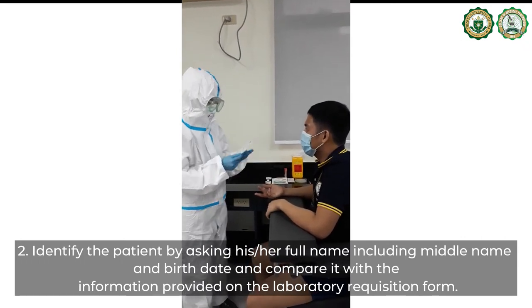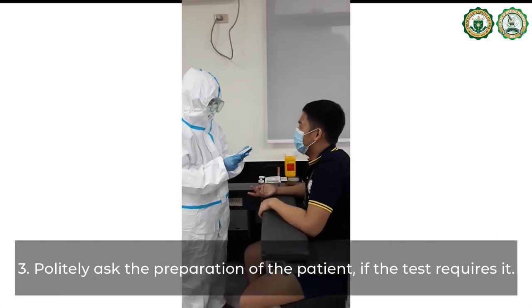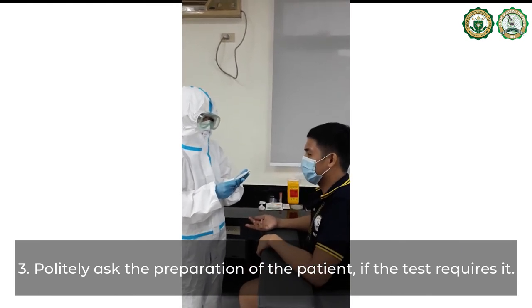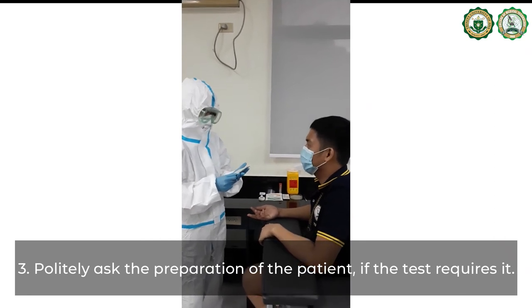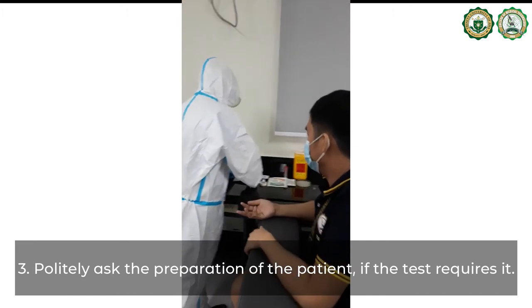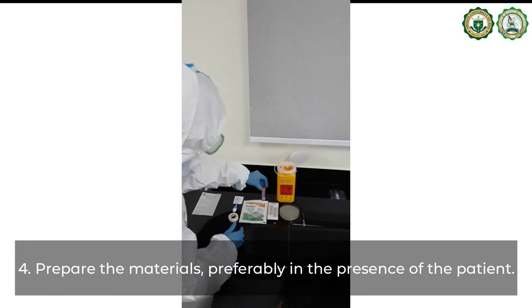Compare it with the information provided on the laboratory requisition form. Politely ask about the preparation of the patient if the test requires it. Prepare the materials, preferably in the presence of the patient.